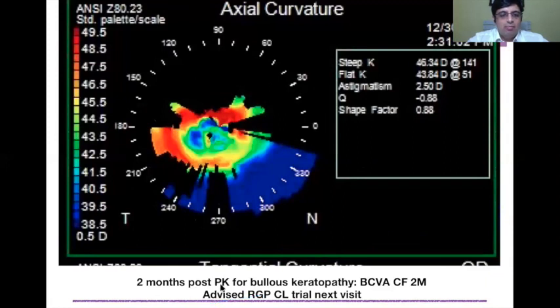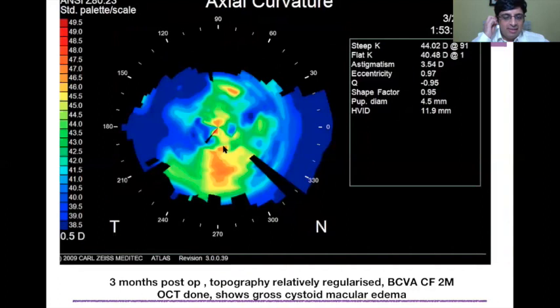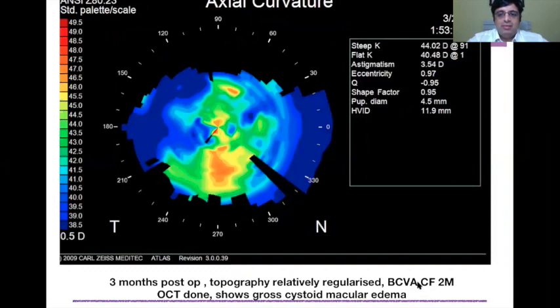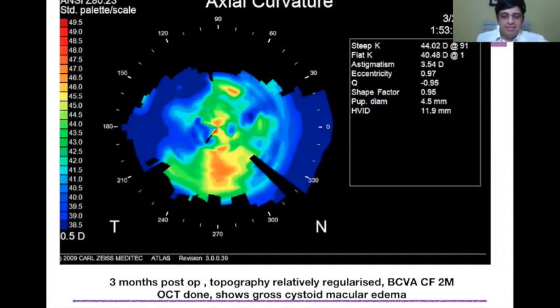An irregular topography pattern with multiple undetected points and a haphazard pattern was seen in a 66-year-old male who underwent penetrating keratoplasty for bullous keratopathy, presenting with BCVA of CF 2 meters at two months post-op. One month later, the topography had regularized to show a steep axis and flat axis with steep K of 44 and flat K of 40 — yet BCVA still did not correlate. Since the fundus appeared clinically normal, macular OCT was performed, revealing gross cystoid macular edema, for which Nepafenac eye drops three times daily and intravitreal Avastin were initiated. In this case, topography helped determine that the cause of vision loss needed further investigation, prompting the macular OCT.